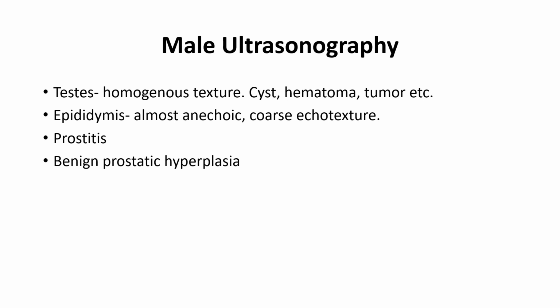Now we come to male ultrasonography. The points to be evaluated are the texture of the testes. You can observe cysts, hematomas, tumors, and if you want to scan the epididymis, it is almost anechoic, as it has the sperms in it, and you can see the anechoic image.